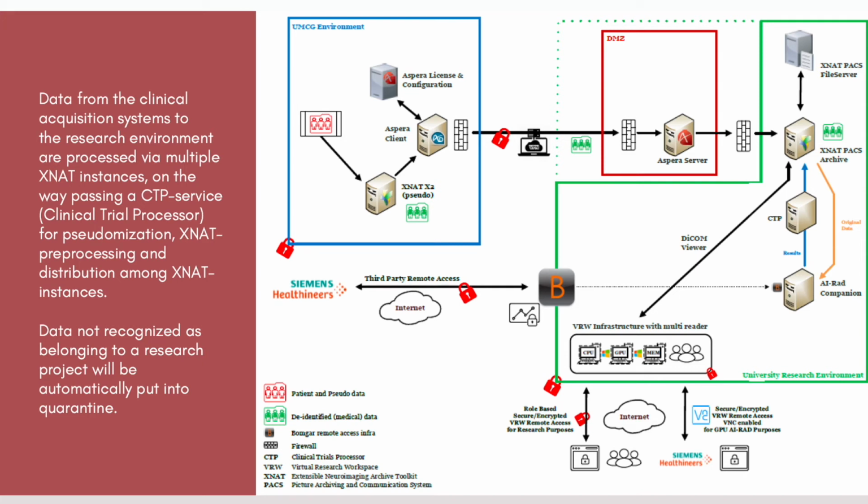Extensions to XNAT to handle bulk data processing for the validation of the AI algorithm are currently under development and will include project-based bulk data export from XNAT for training our own models and bulk data transfer to AI tools for validation of the AI-based imaging biomarkers.